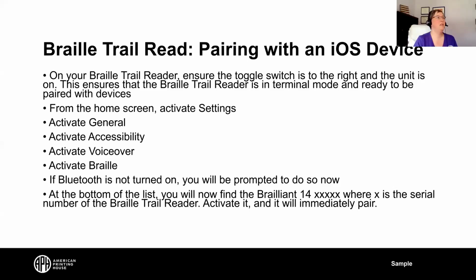Okay, I'm going to take two more and then let you go on, and then we'll capture more questions. The pairing with a smartphone for someone who might be deaf-blind using a GPS app, is that possible? And are we going through the steps of connecting with an iPhone, iPad? Yes, we certainly will. That is our next tackling point, pairing. And yes, you could use the device with any application that's accessible on the iPhone. So if you're using Google Maps, for instance, you could certainly navigate that application with this Braille display.